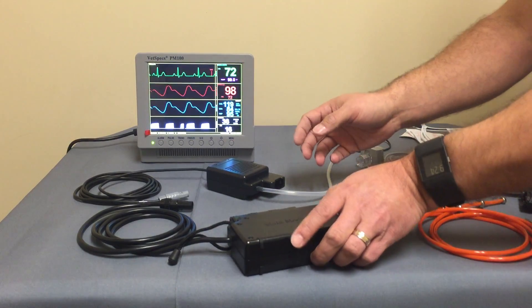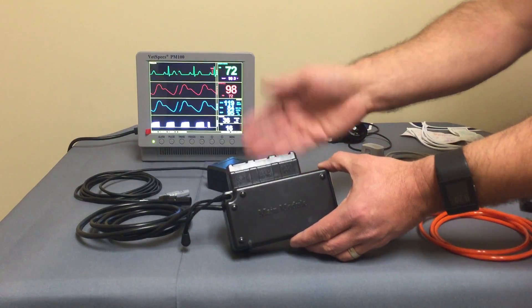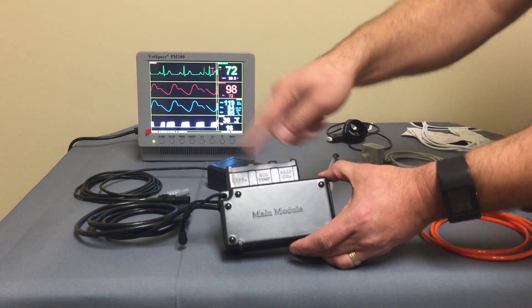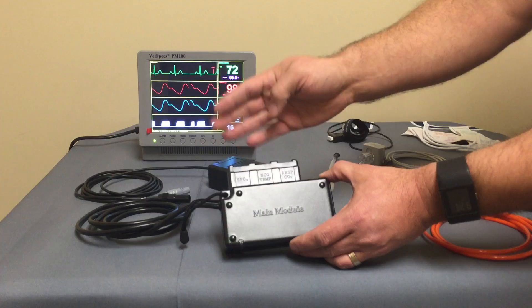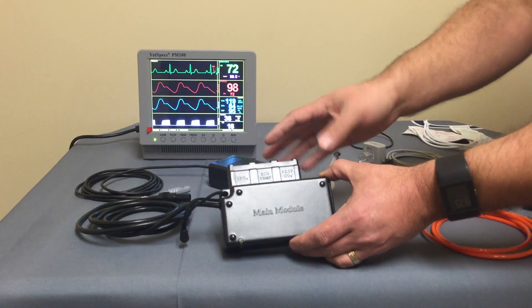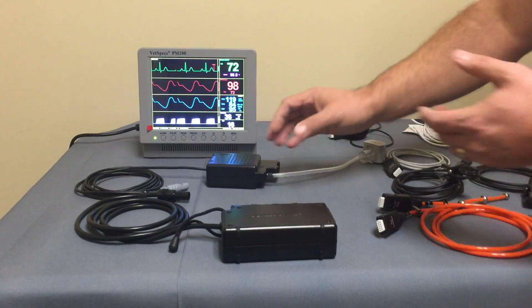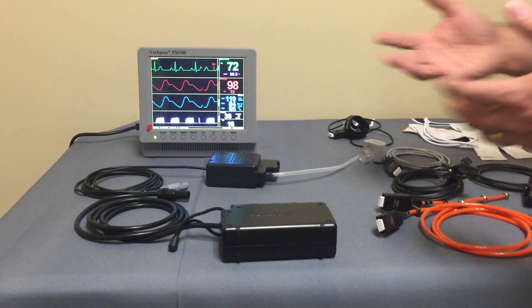They've manufactured these external modules. For instance, this is the multi-parameter surgical module — their main module. This module contains all the electronics for your ECG, temperature, pulse ox, and respiration circuitry, so all the processing is done here. This is the blood pressure module, and these are the two modules you would get and use for surgical applications.